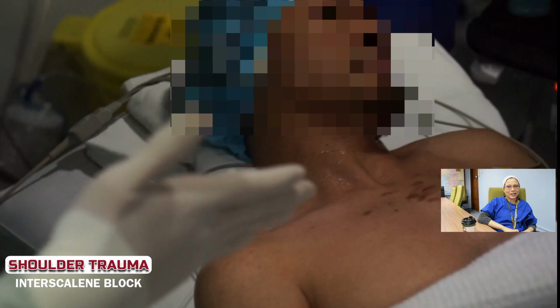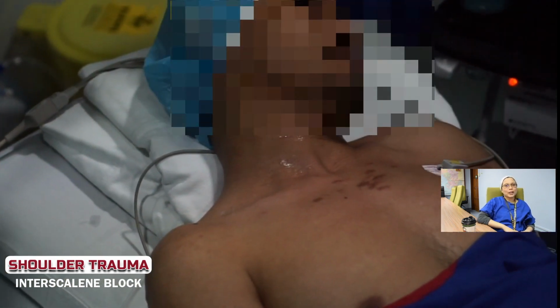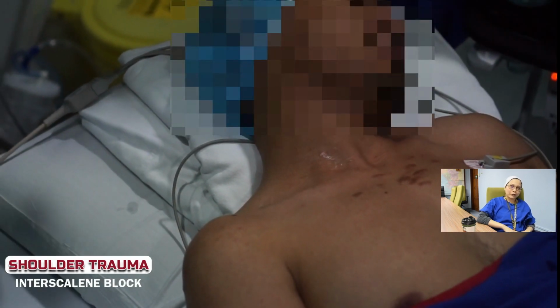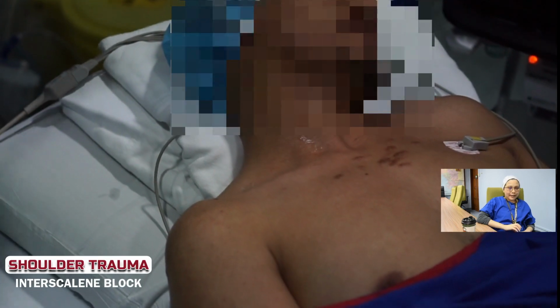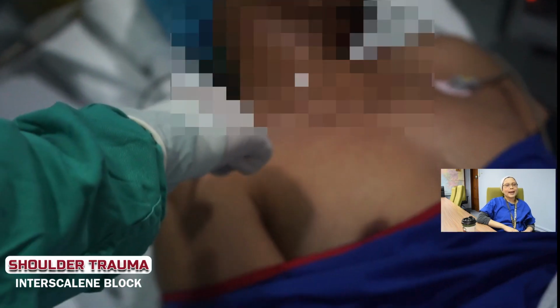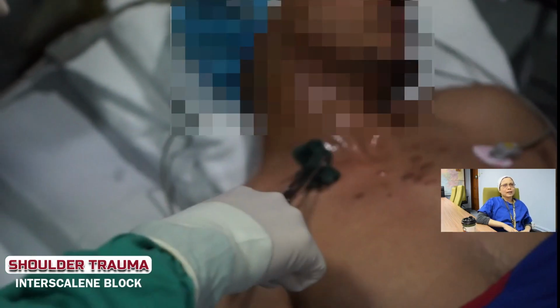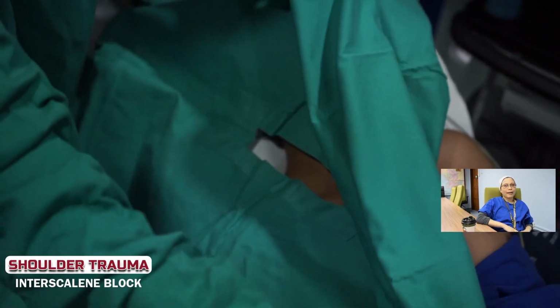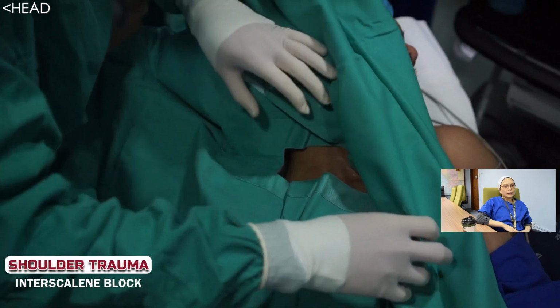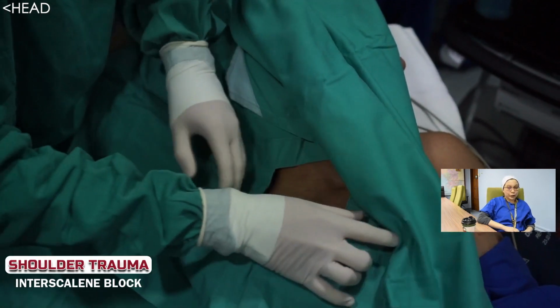Let's talk about interscalene block. So first of all, the patient should be in a supine position with the head slightly elevated and turned away from the operator. The patient's neck and upper chest need to be exposed, cleaned and draped prior to the block. The most important landmarks here are the clavicle and the sternocleidomastoid muscle. A high frequency linear probe is then placed transversely at the supraclavicular fossa.